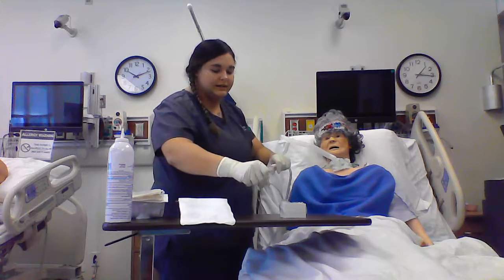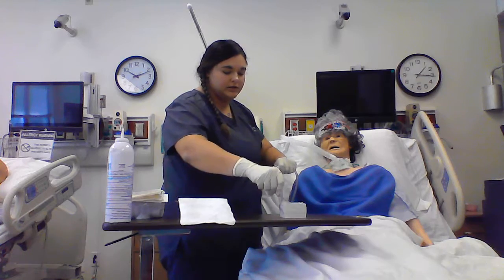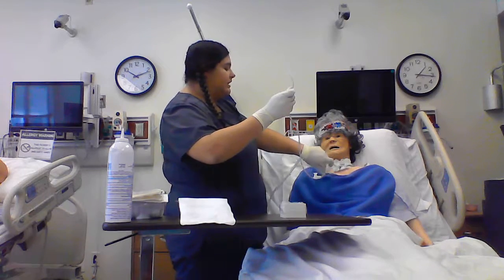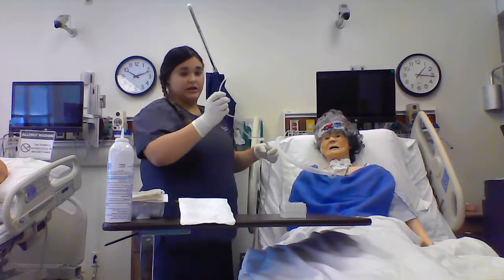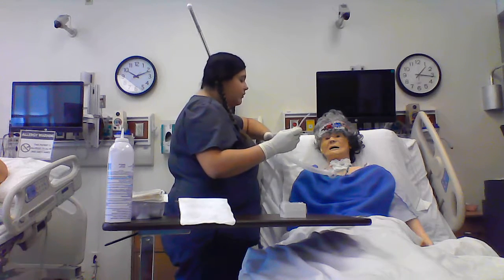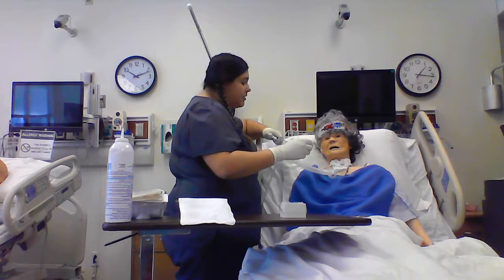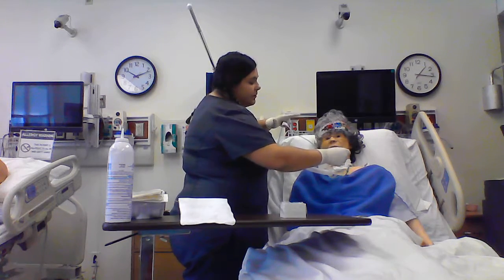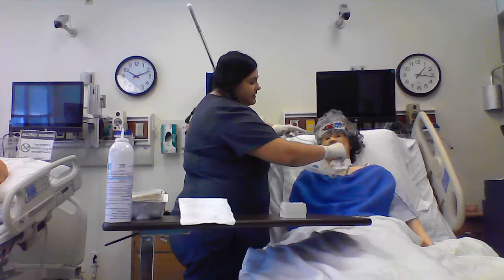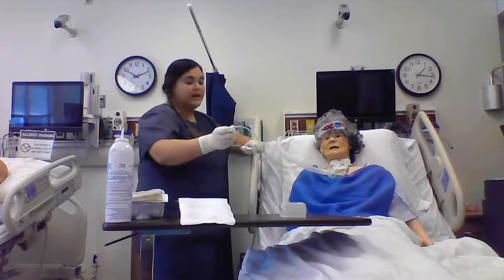I'm going to test my suction. It works. I'm also lubricating the tip of this. And then at this point, I'm going to take off Miss Opal's oxygen and remind her how she can help me. Okay, Miss Opal, remember, if you need a break, or if you're having any pain, or if you're having a hard time breathing, just let me know, raise your left hand, and I'll stop. So I'm going to make sure I'm not suctioning on the way into the cannula, and I'm going to go in until I meet resistance, and intermittently suck on the way out. Making sure to twist on the way out, that way I can get all the secretions around the cannula.